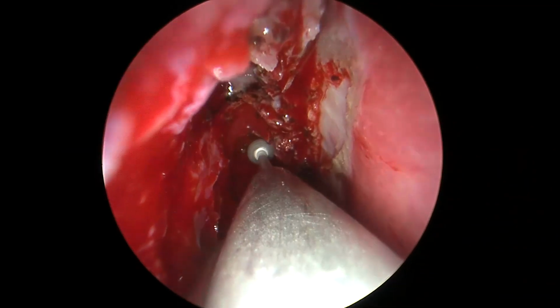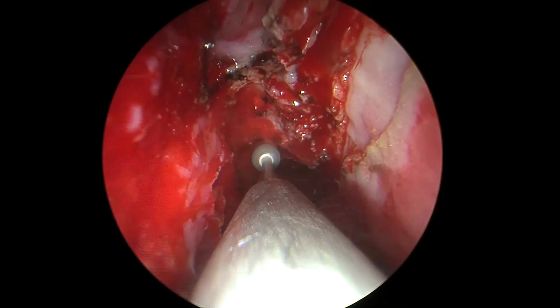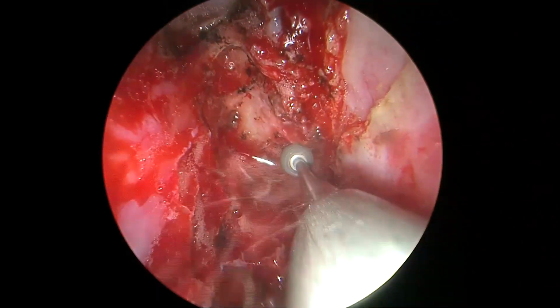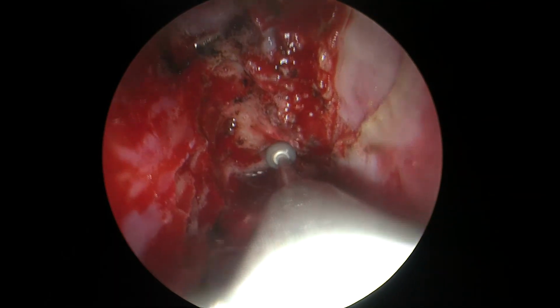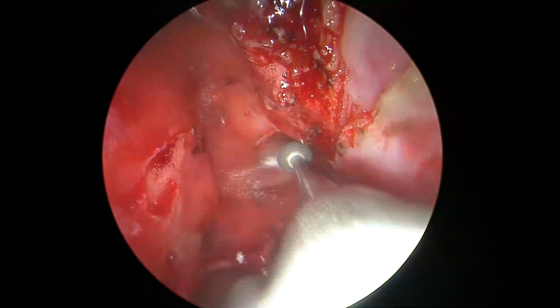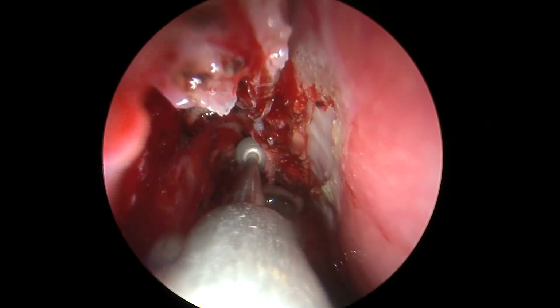The rest of the bony septations on the ethmoids and the attachment of the middle turbinate can simply be drilled off and smoothened using a diamond burr. We prefer to use a 4 mm diamond burr for this purpose. It's a fine diamond, not a coarse diamond. We do not want to create any more defects in the skull base. This is merely to polish the bone and smoothen it out, to prepare a nice flat, bare bone bed for our grafts to adhere.